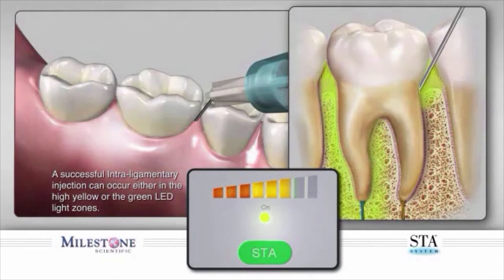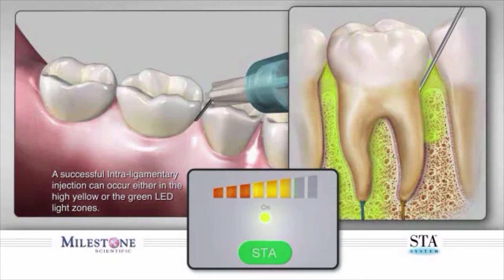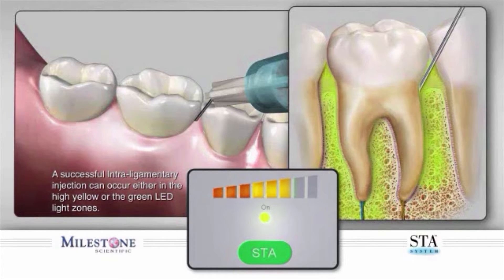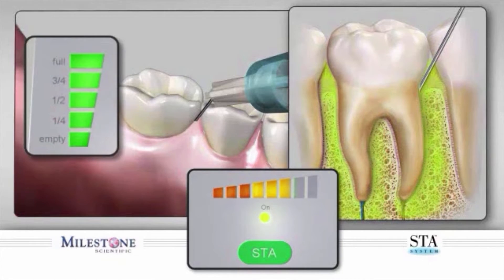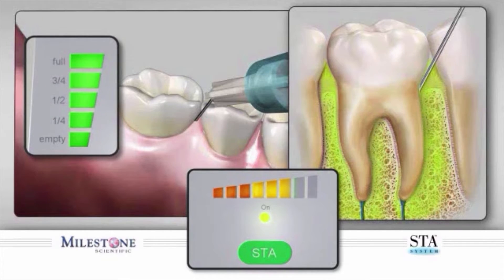The wand system will once again begin to determine proper location by dynamic pressure sensing. It is important to be aware that you may achieve success while in the high yellow zone. The high yellow LED zone indicates that you have a high probability of being at the correct location to perform the STA intraligamentary injection. It is necessary to maintain at least the high yellow LED indicators throughout the injection process to achieve success. Note that you will not hear the audible spoken word PDL in a yellow zone. A successful STA intraligamentary injection can occur in either the high yellow or green LED zones, as both are indicative of the correct location.